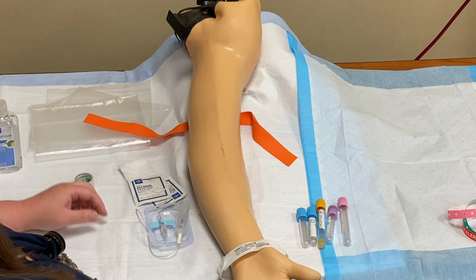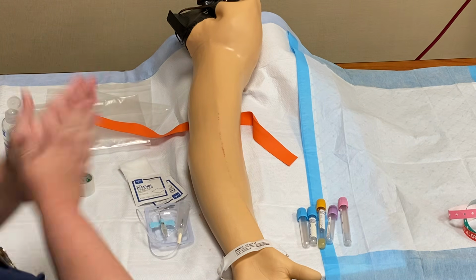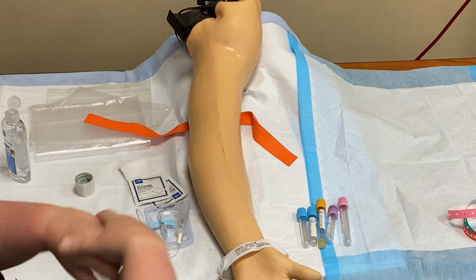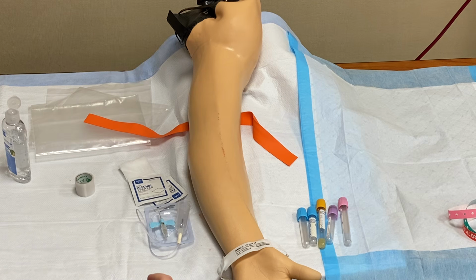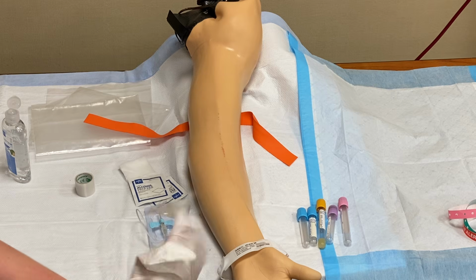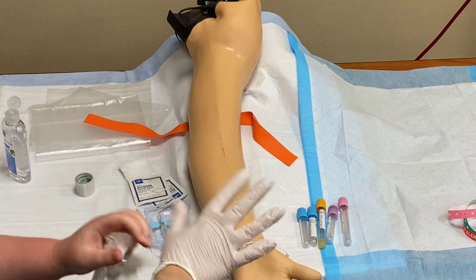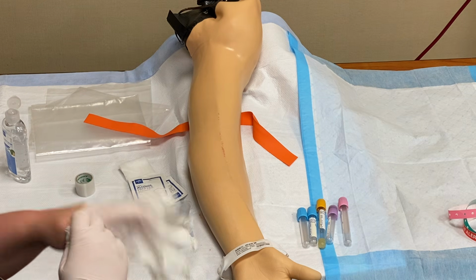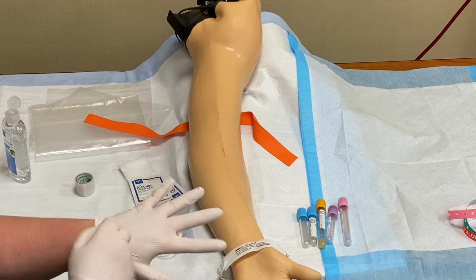Now I'm ready to put my gloves on so that I can do the stick. So I'll wash my hands first. Put my gloves on, and I'm gonna get ready to clean her arm. The entire time that I'm working, I want to make sure I'm letting my patient know what I'm doing. This will help reduce her anxiety, and that will actually help me find a vein better.